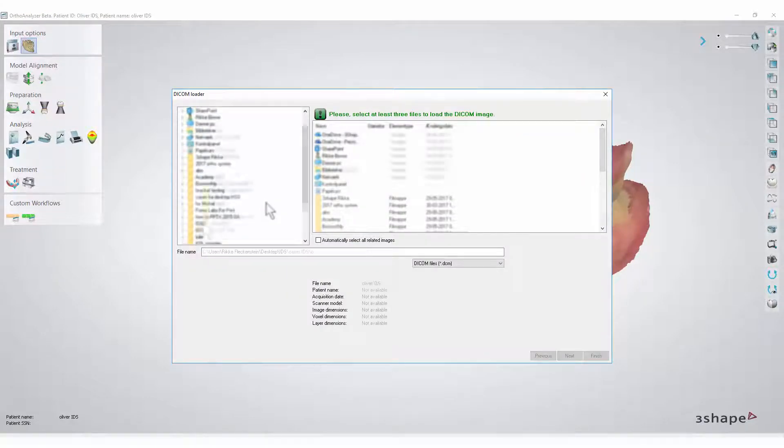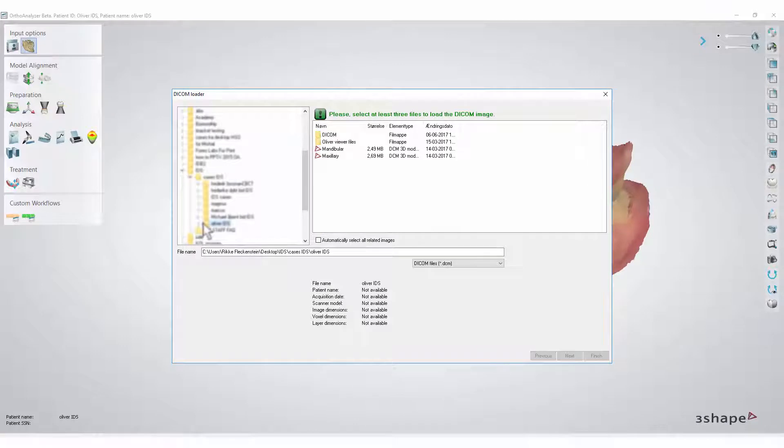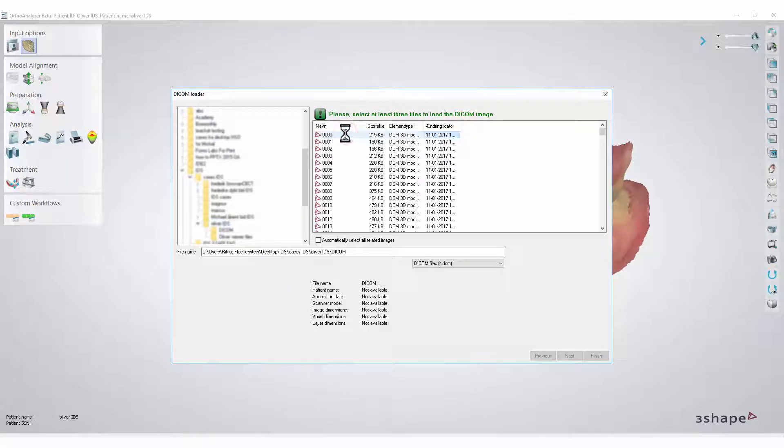Now search for the desired DICOM files on your desktop. Once you've found the right folder, open it and you will see all the DICOM files in a list.